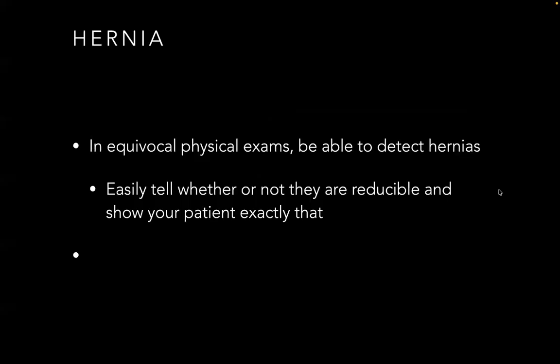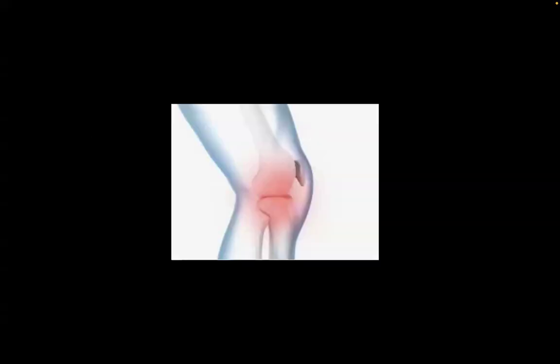So you can easily tell whether or not these hernias are reducible and show your patient exactly that by showing them the ultrasound screen and showing them exactly what you see. And that's one of the benefits of using POCUS at the bedside. You can use your ultrasound images to show your patients exactly what you're seeing as well.